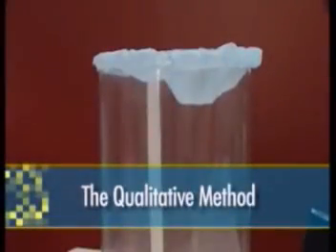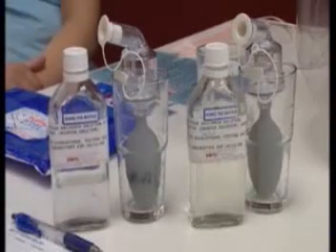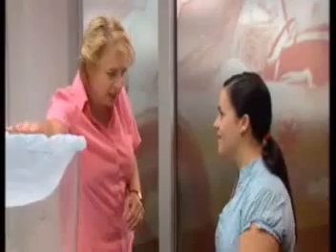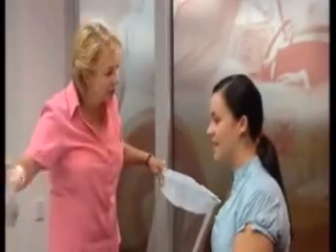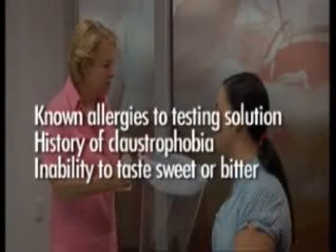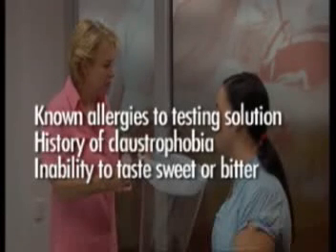Qualitative testing requires the use of an enclosed transparent hood, testing solutions and atomizers. The effectiveness of this test relies upon the person's ability to taste either a sweet or bitter solution. The person should abstain from eating, drinking and smoking for 30 minutes prior to the test as this may affect taste. Contraindications for this method are known allergies to the testing solution, a history of claustrophobia, and an inability to taste either a sweet or bitter solution.